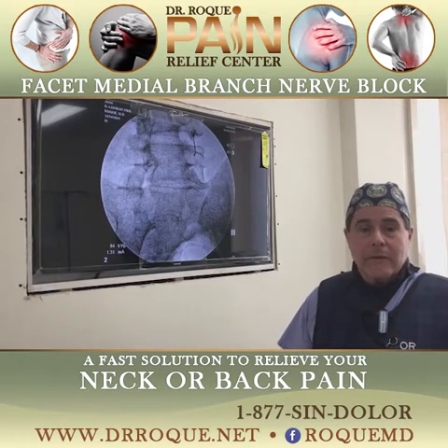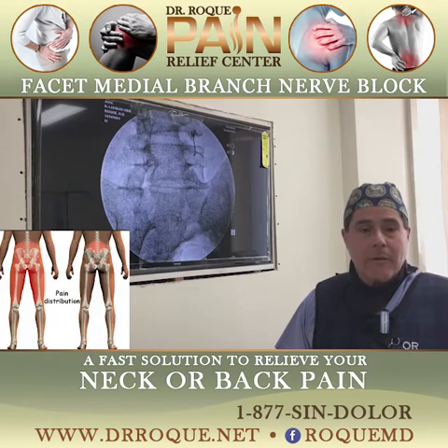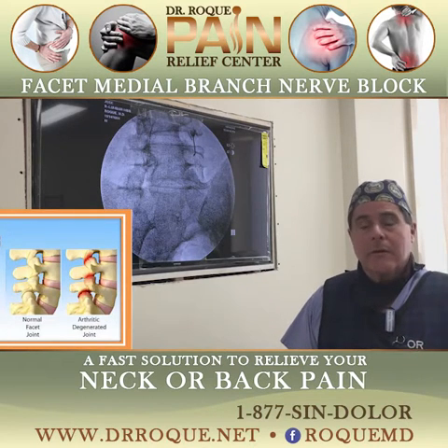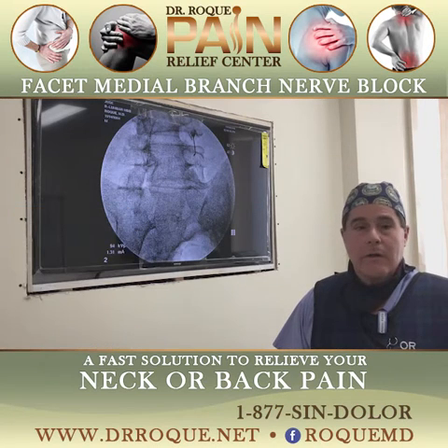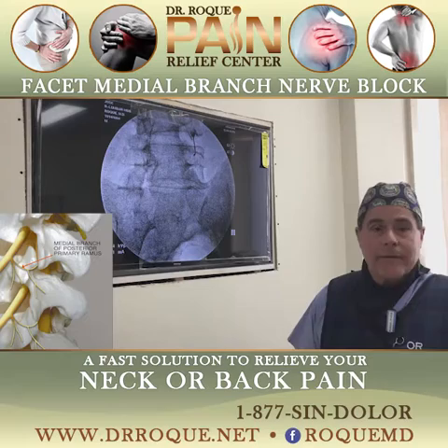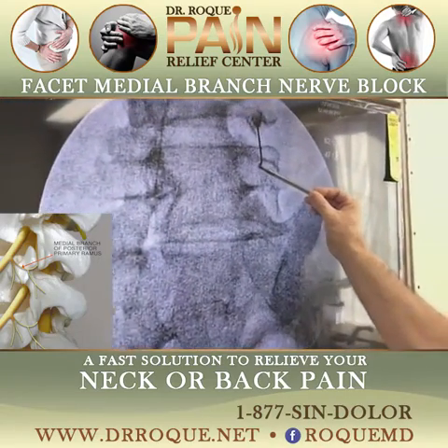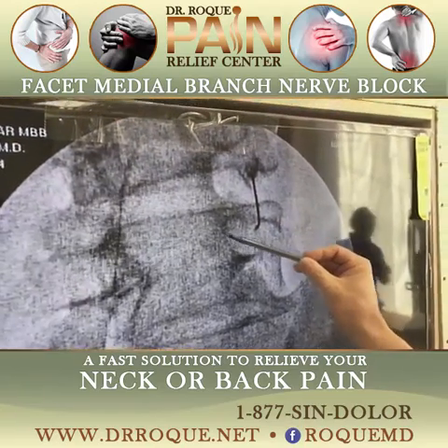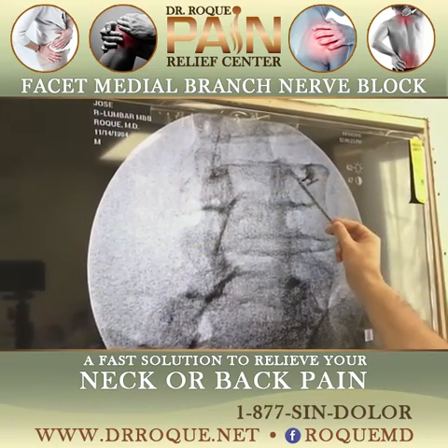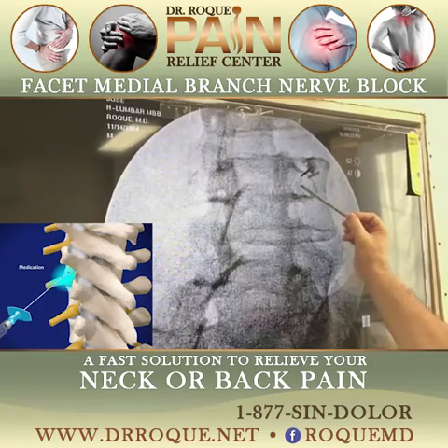So you have here a 32-year-old veteran, presently a police officer, with severe right-sided low back pain. MRI was performed. It shows that he has arthropathy, or degeneration of the facet joint. We have done physical therapy — he has not gotten better. He has taken anti-inflammatory medication and he's still not getting better. So today we're doing a fluoroscopic guided right-sided lumbar L3 medial branch block. Basically we're putting a little needle under sedation at the medial branch nerve which lies in the region of the facet joint. And we're actually putting two medications at the medial branch nerve at the L3 level — an anti-inflammatory and a local anesthetic.